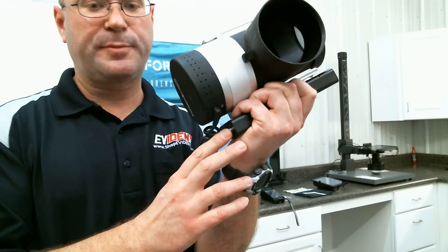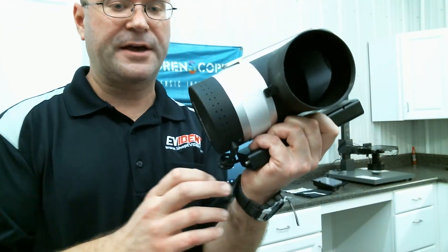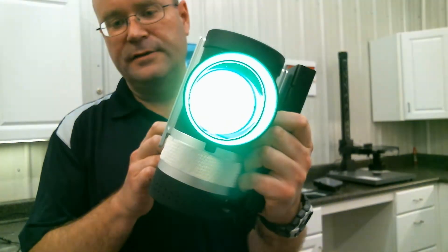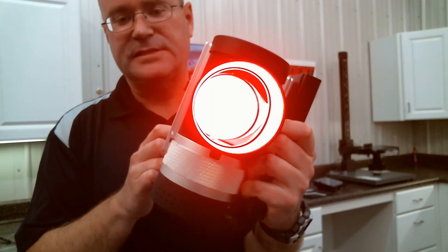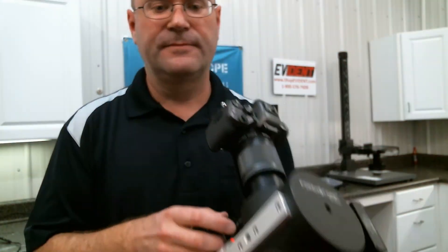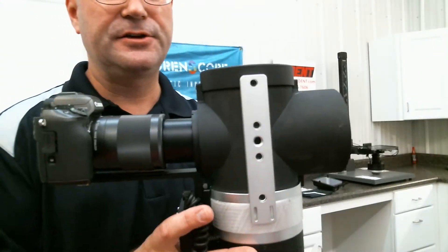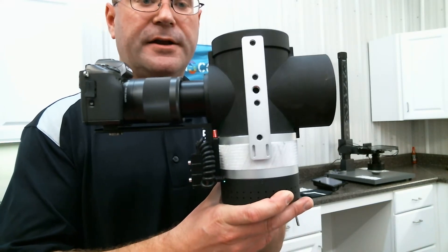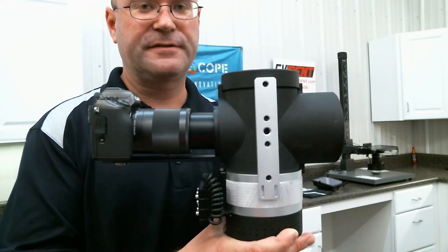There's an external power supply here. I'll turn that on and there are white, blue, green, and red LED light settings. This device is really easy to use. It's intended for use with untreated fingerprints on non-porous reflective surfaces.